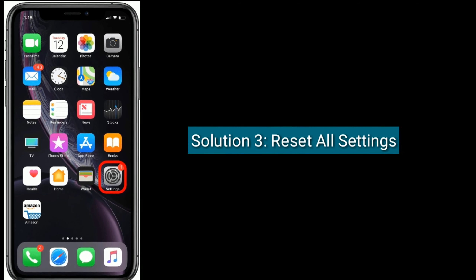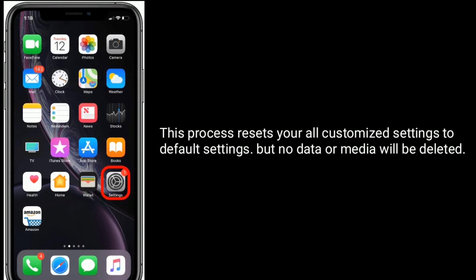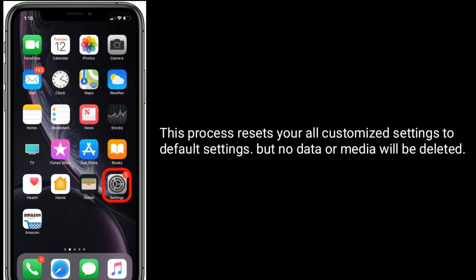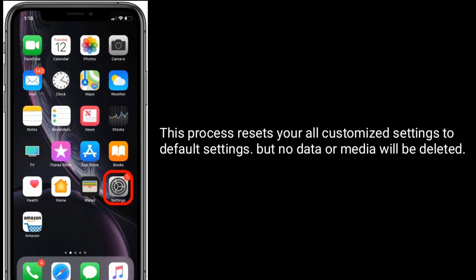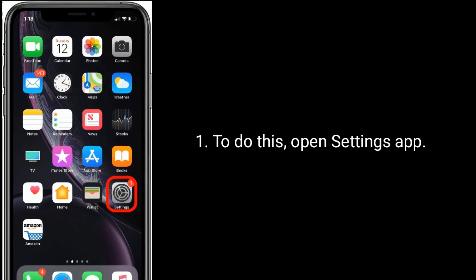Solution 3 is reset all settings. This process resets all your customized settings to default settings, but no data or media will be deleted. To do this, open the Settings app.